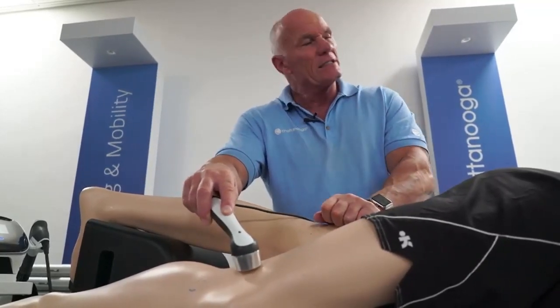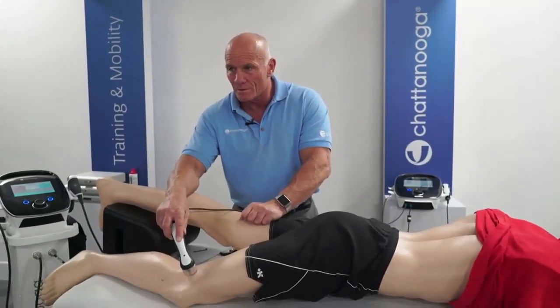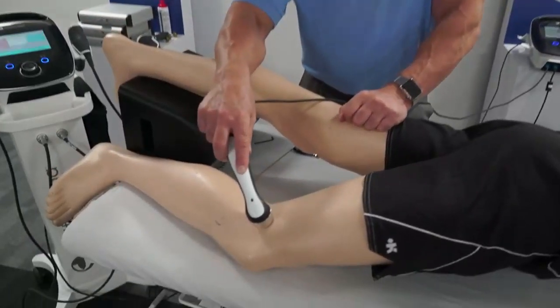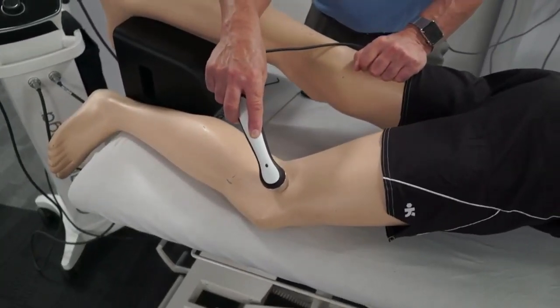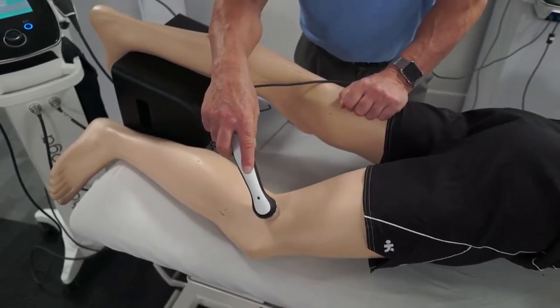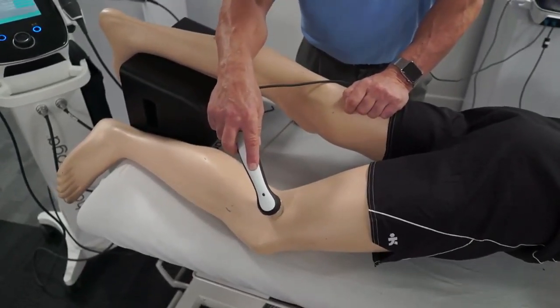Then we're going to work in small oscillatory movements. This is because the biological effects are due to cavitation and standing waves.